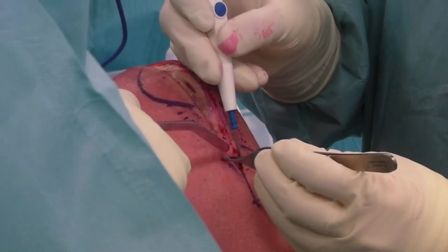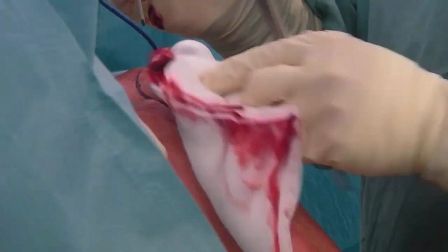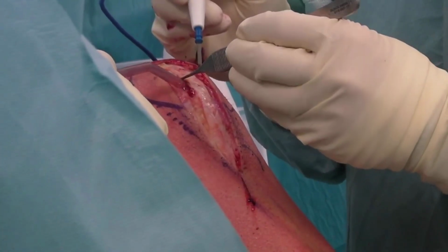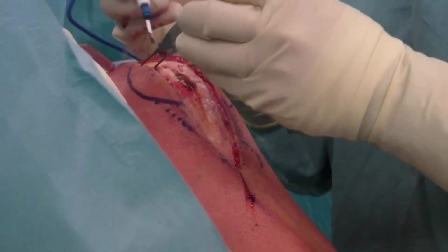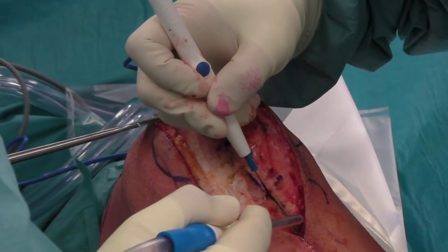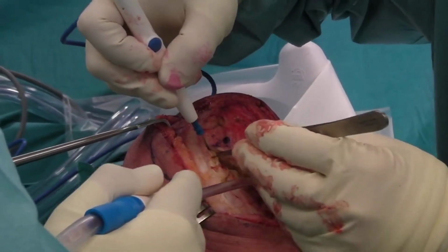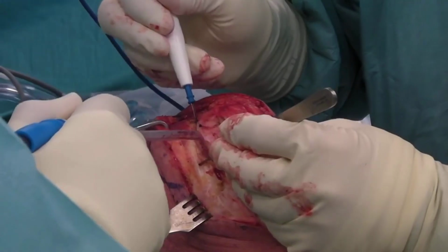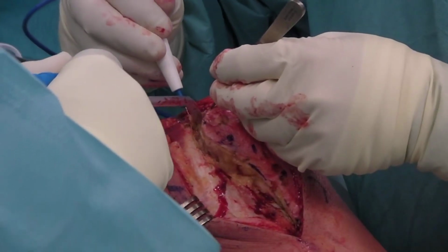The same instrument we use to coagulate bleeding vessels is also used to cut deep, soft tissue, with the undoubted advantage that this instrument cuts and coagulates arteries and veins at the same time. In a few steps, we reach the joint capsule, which we open with a curved incision, again using the electric scalpel, which in this case also allows us to coagulate the arteries and veins at the same time as we cut the tissue.